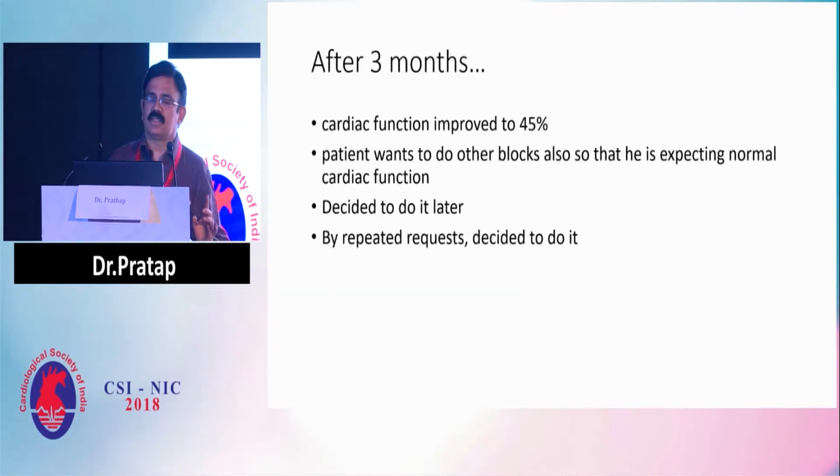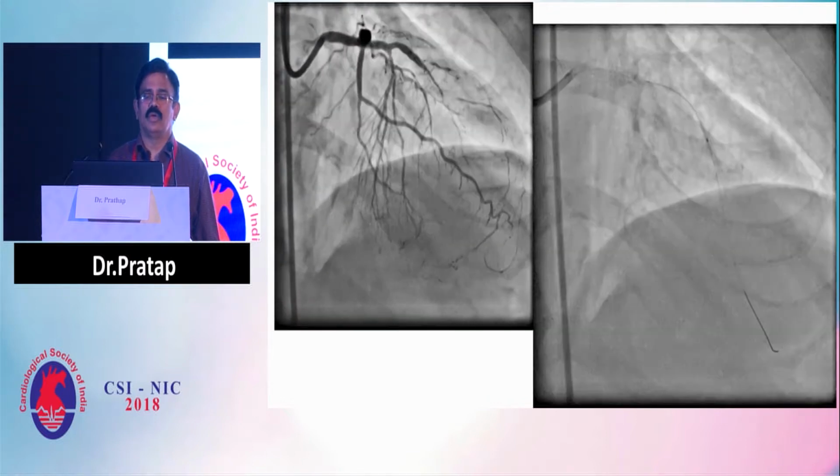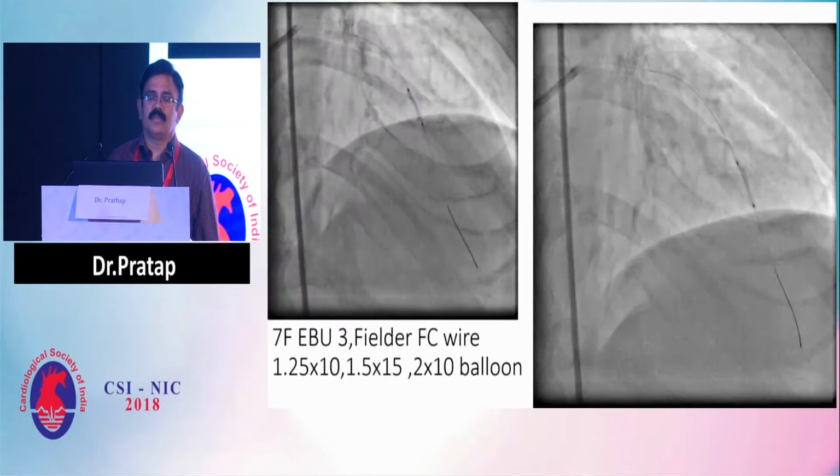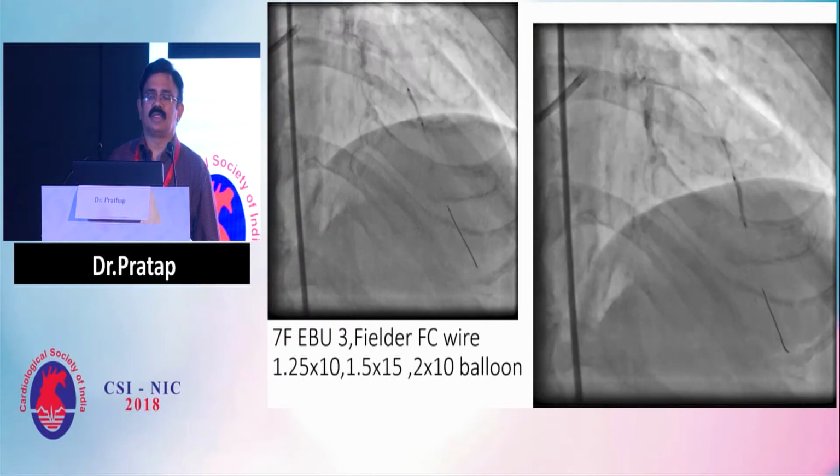And after 3 months, the cardiac function improved to 45%, and the patient wants to do the other blocks and decided to do LAD. I passed the wire. There was a real difficulty of taking the catheter down.